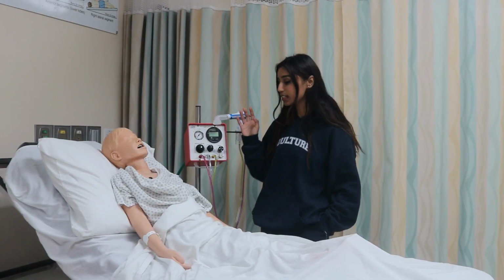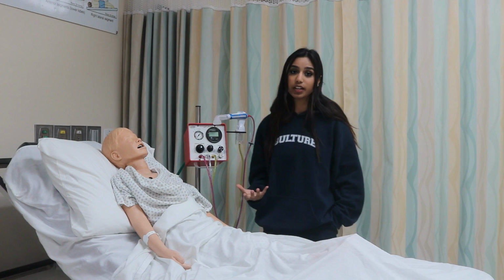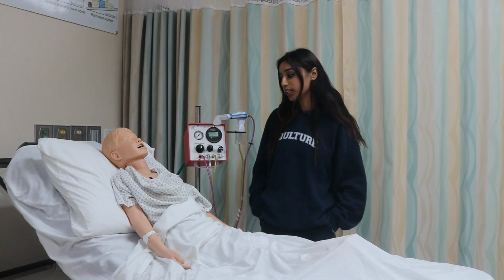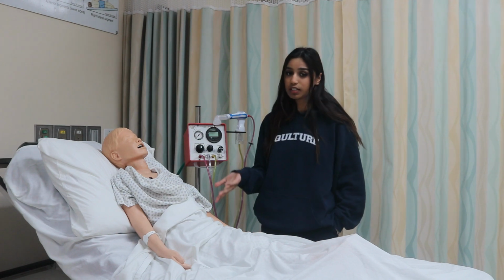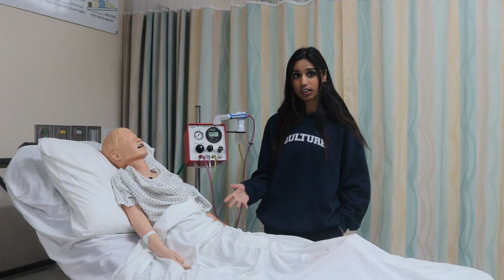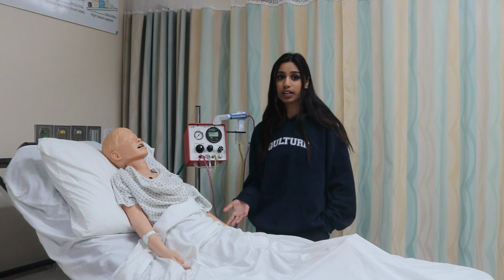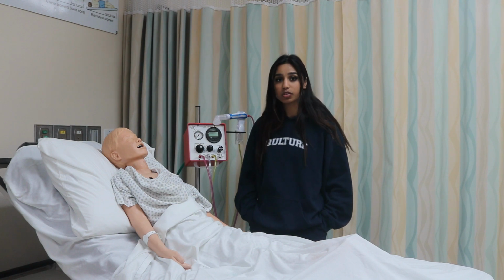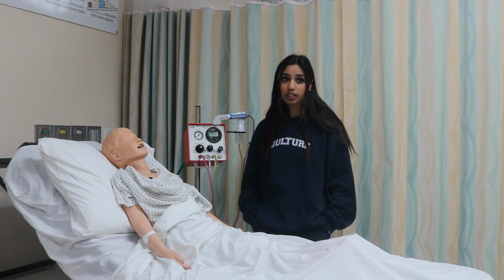So the IPV doesn't actually cure any disease, but rather helps with secretion retention or treats atelectasis. So for example here, if Ron had cystic fibrosis, this machine would be great in helping him. The IPV would be used in providing an alternative delivery system for bronchodilator therapy, providing intrathoracic pressure and vibration, and providing an alternative system for delivery of positive pressure to the lungs.